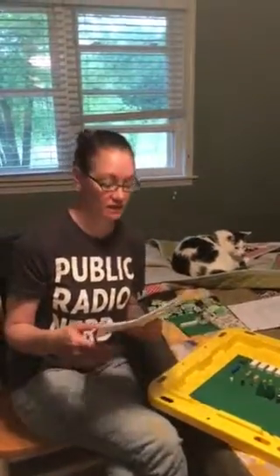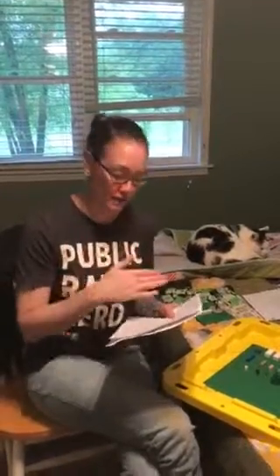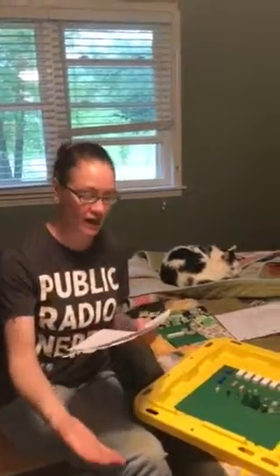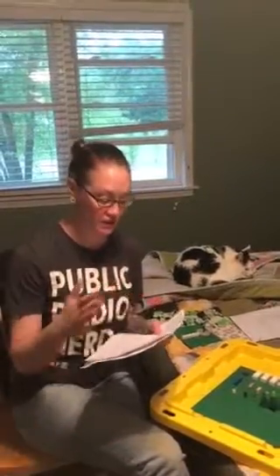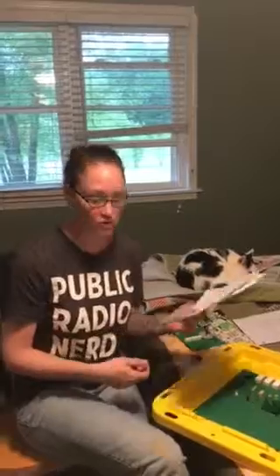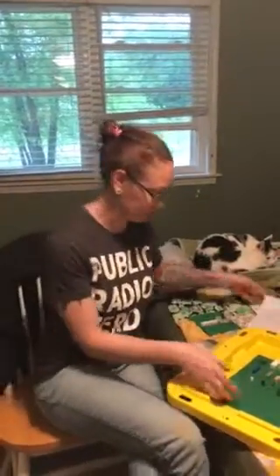Another way that I have found to explain gradient spoiling is to think of having a whiteboard that you filled all your information out on and then completely erasing it. That's the applied or spoiled gradient at the end of class, which would be your end of TR. Then the new class, or the new lines being sampled, will be fresh and clean. So it wipes out that residual transverse magnetization.